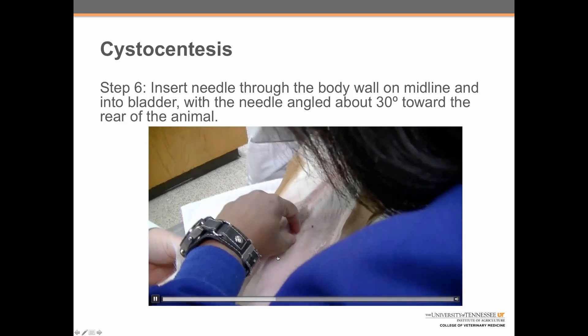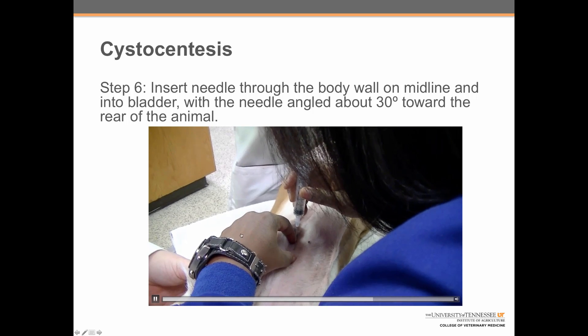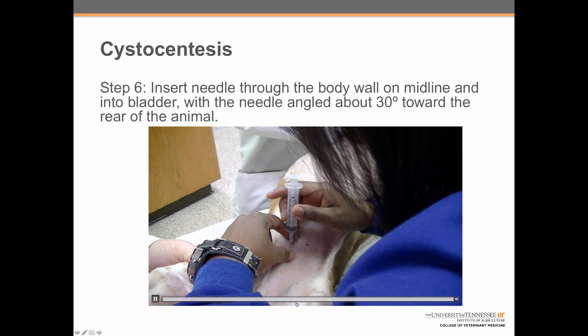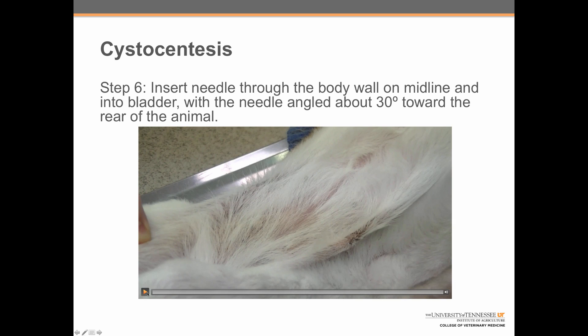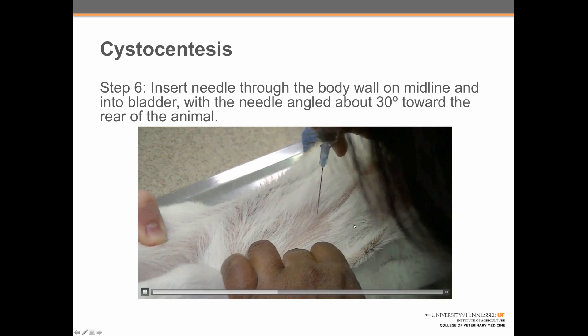In the male dog, this position is going to be on midline just slightly to the side of the penis with the penis pushed to one side. The needle is inserted at about a 30 degree angle towards the back of the animal. In the female, when the bladder cannot be palpated, the needle is going to be inserted at the point of maximal alcohol pooling.